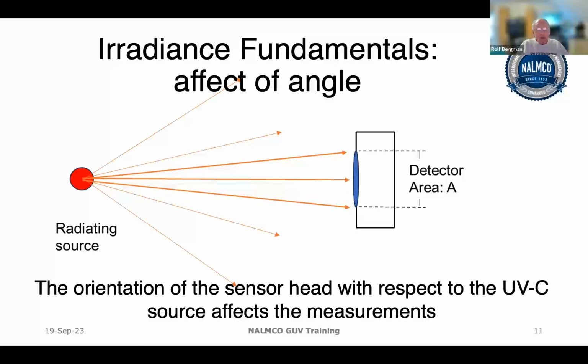I go back to the calibration. There should be a calibration certificate with the detector, so that you're sure your measurements are accurate. If the certificate is very old, the unit may need recalibration, which is a very expensive proposition. So one way or another, the accuracy of the device needs to be ascertained.